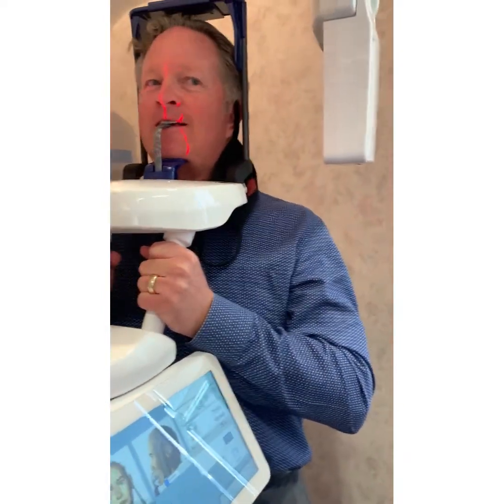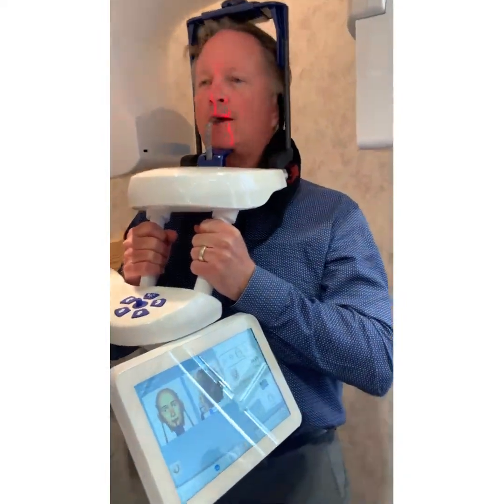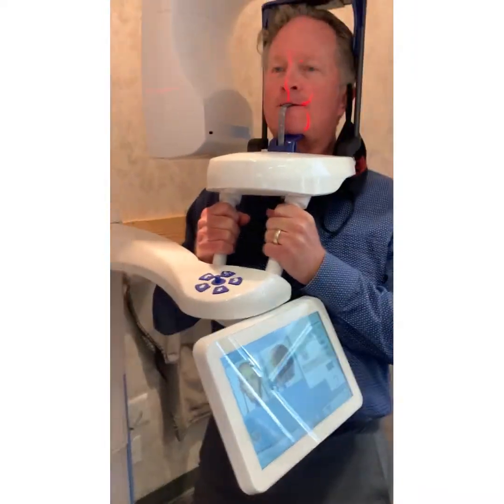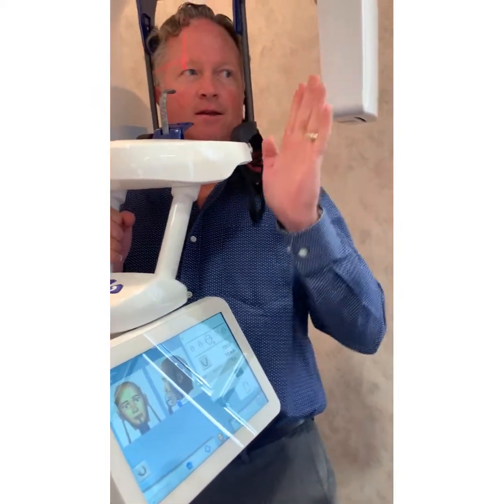So you do have to lean back a little. I usually have them hold the thing, and then I put my foot there until they touch my foot. Perfect. That's not water ski position. That's just making sure that they're straight. If they let go and fall down, they're too far forward. But they should still be like this, where there's a little bend going this way.